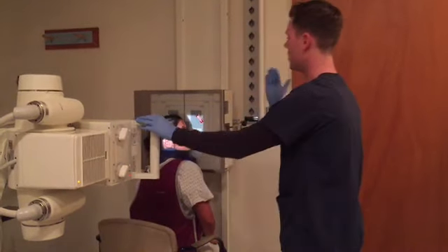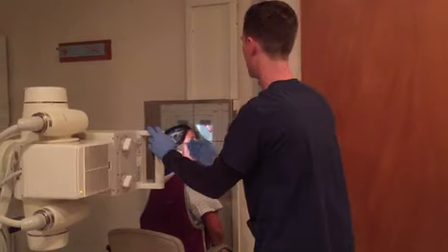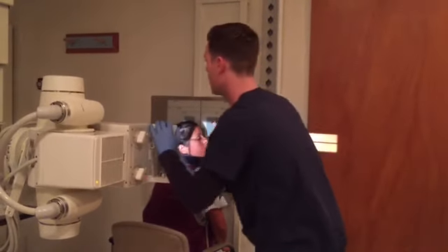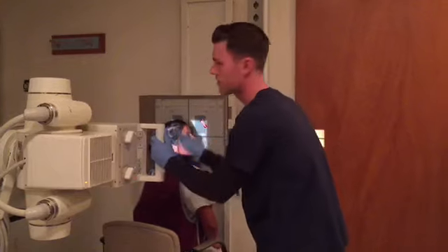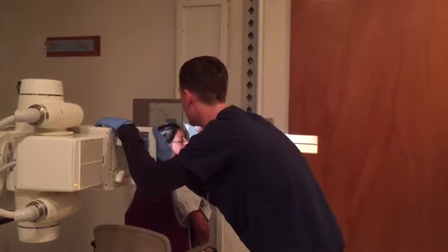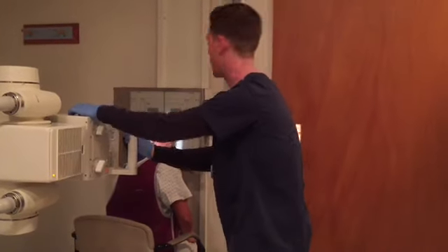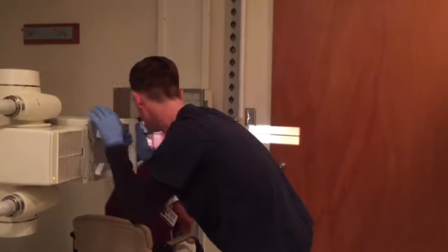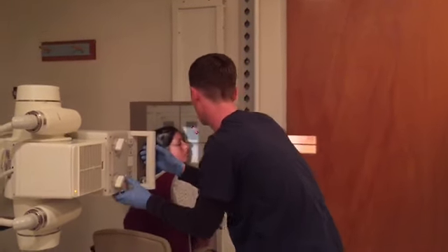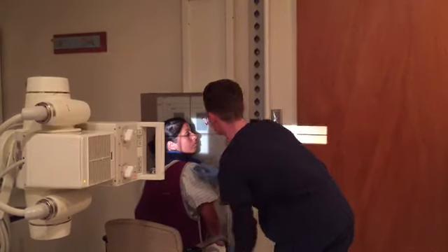On this one, we're going to have the mid-sagittal plane parallel to the IR, and the interpupillary line is going to be perpendicular to the IR. Central ray is horizontal still, it is for all the projections, and we're going to be using an 8x10. And it's going to enter about a half inch to an inch posterior to the outer canthus. So that's going to be about right there. Maybe just lean back a little bit, right about there.